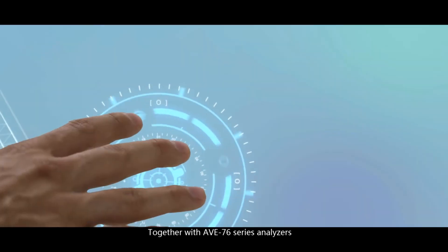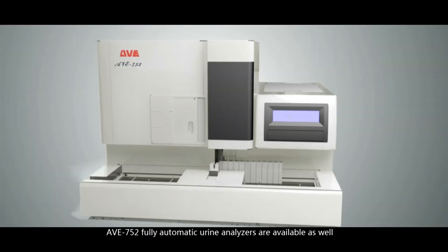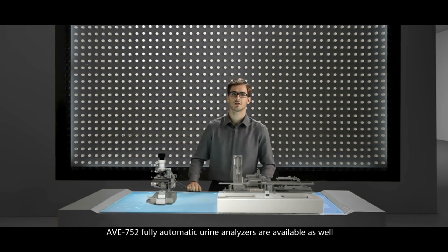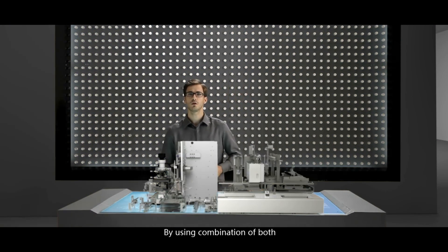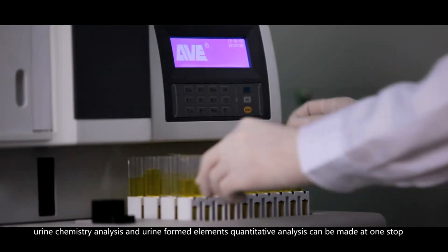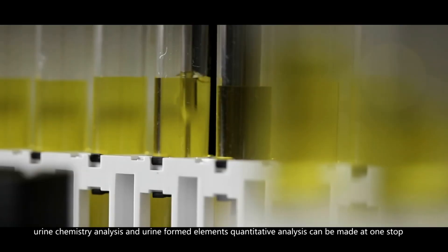Together with AVE-76 series analyzers, AVE-752 fully automatic urine analyzers are available as well. By using combination of both, urine chemistry analysis and urine formed elements quantitative analysis can be made at one stop.